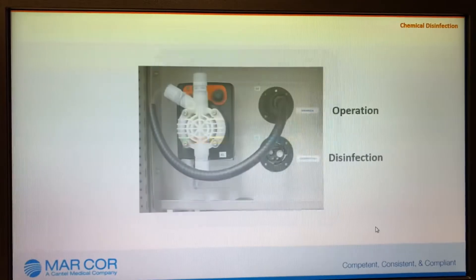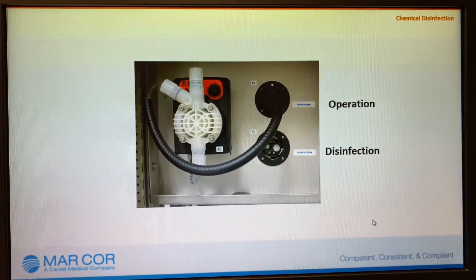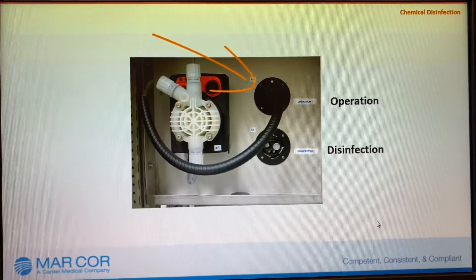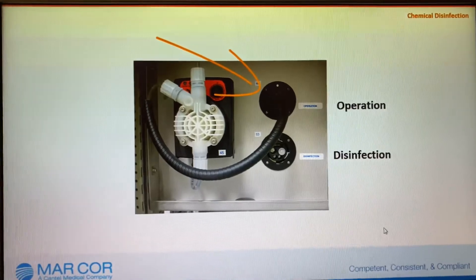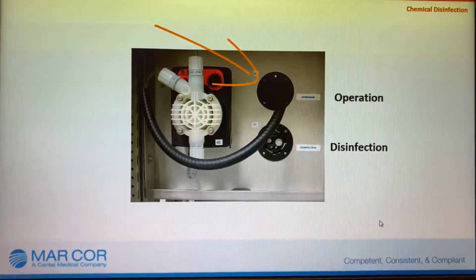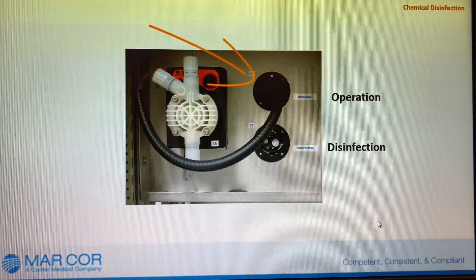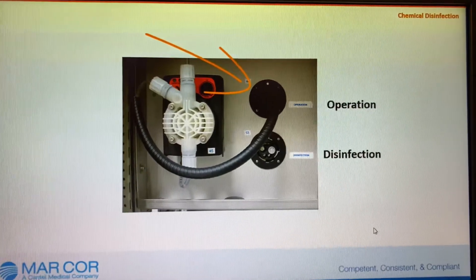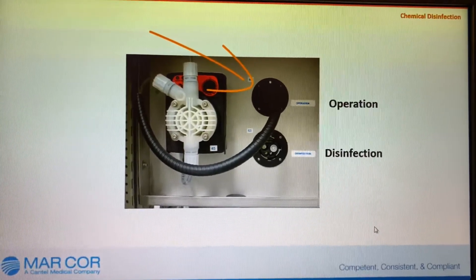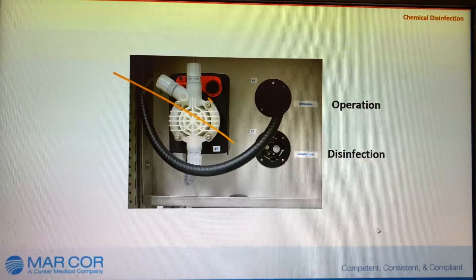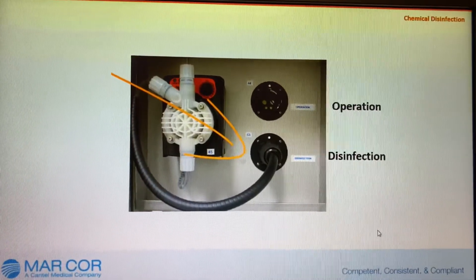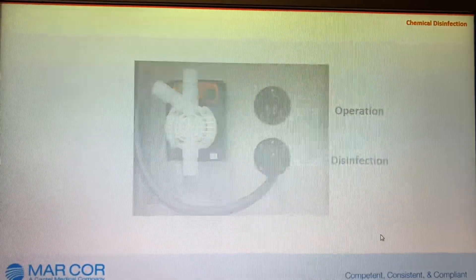When prompted, open the front door on the CWP and move the solution connector, also known as the dosing connector, to the disinfection position. Do this by twisting the connector counterclockwise and pulling the connector outward. Then insert the connector into the disinfection port and turn the connector clockwise to secure it in place.